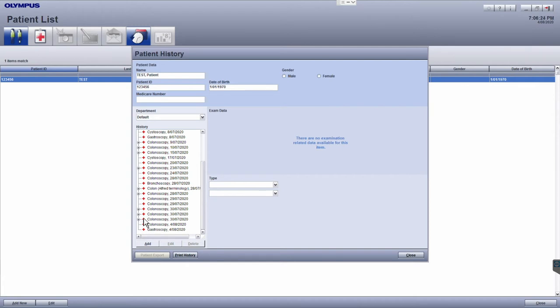To see the particular details for an examination, click on this plus button. Here I can see that four images have been taken and that there is a report that has been created for this examination.